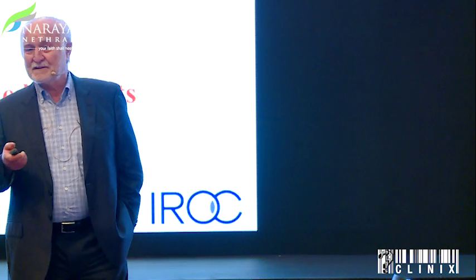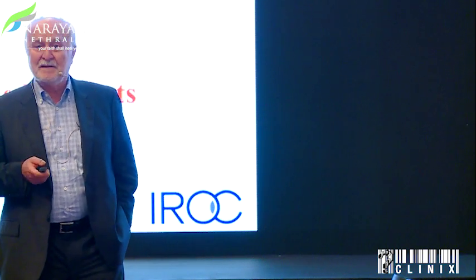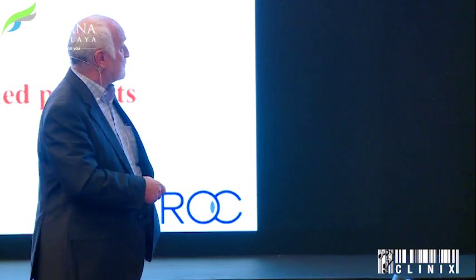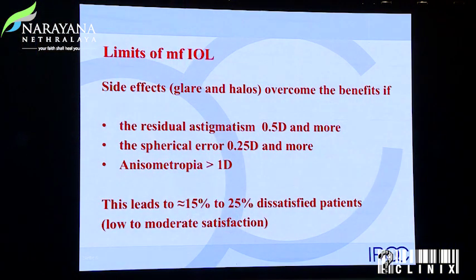In about 75% they are satisfied, but the rest is not. And most of the reasons are residual astigmatism of 0.5 diopter and more, a spherical error of more than a quarter diopter up and down, or an anisometropy between the eyes.